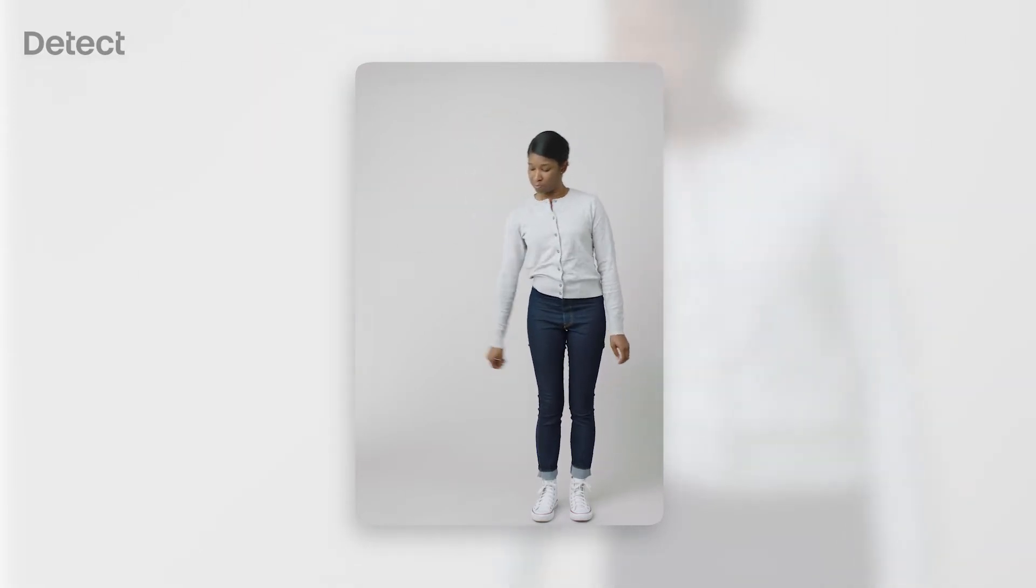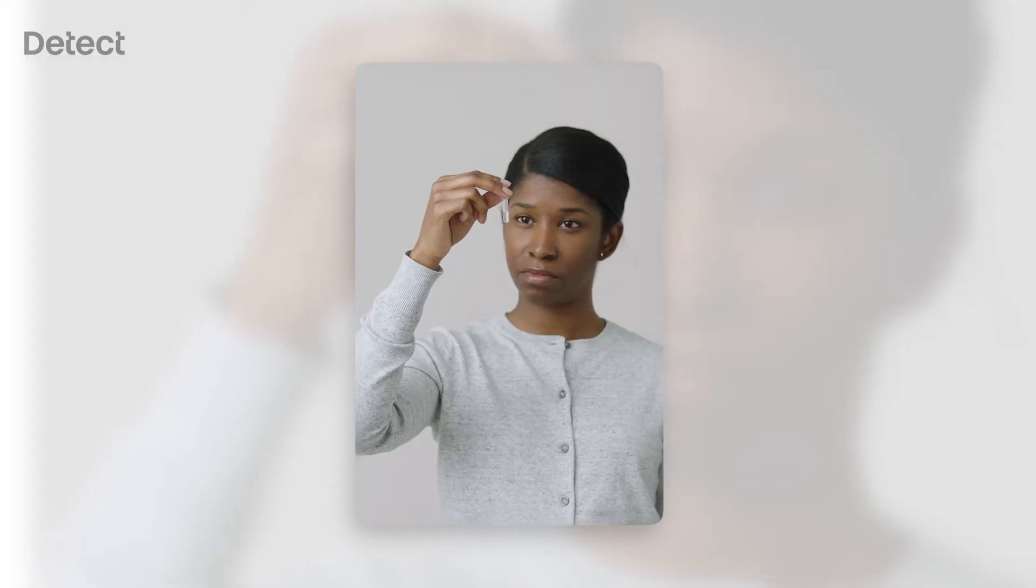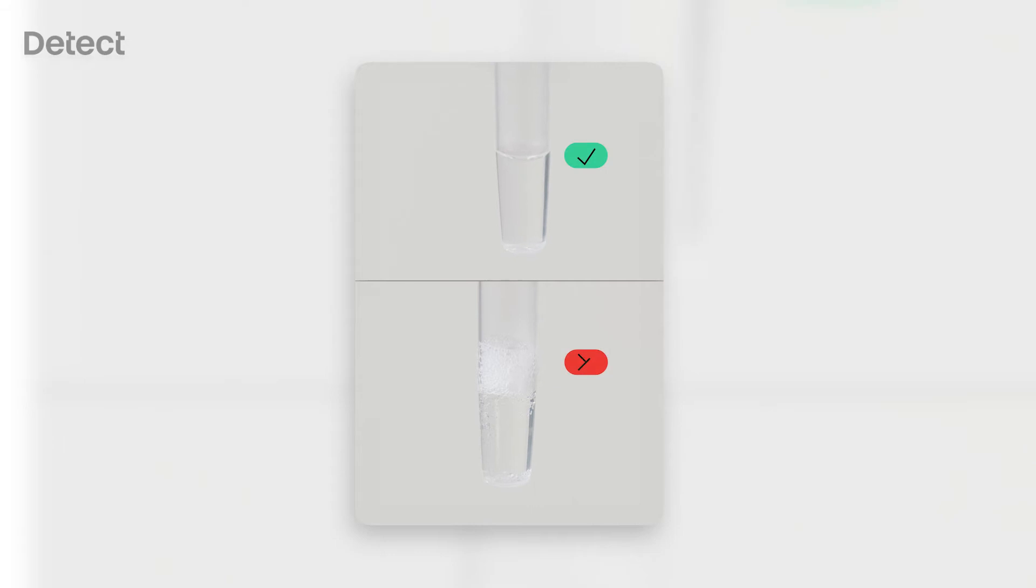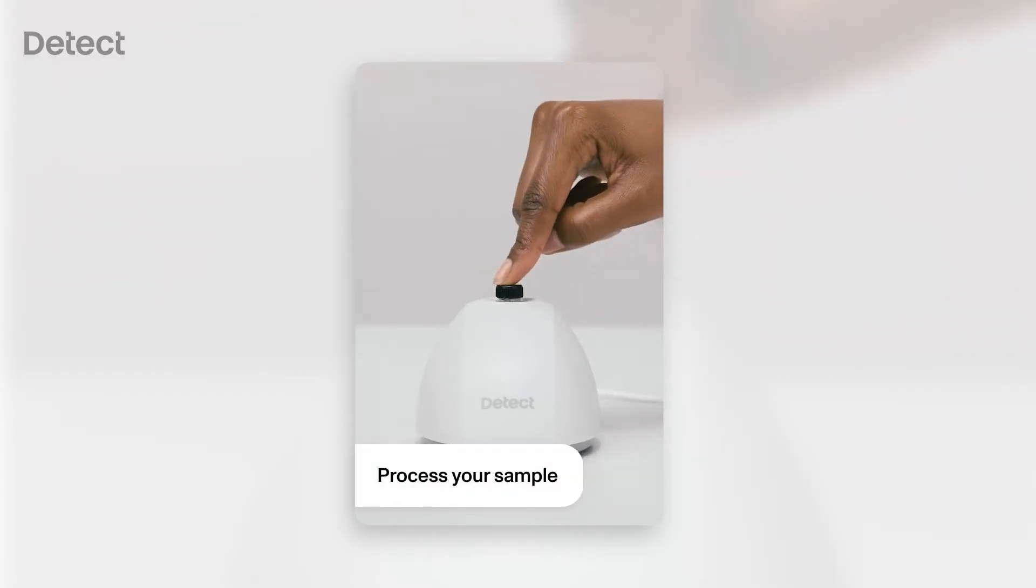Forcefully bring down your arm to collect all the liquid at the bottom of the test tube. No liquid should remain at the top of the tube. Place the test tube into the well of the Detect Hub. The Detect Hub will beep once and the green light will start blinking. Set a timer for 55 minutes so your sample can process.